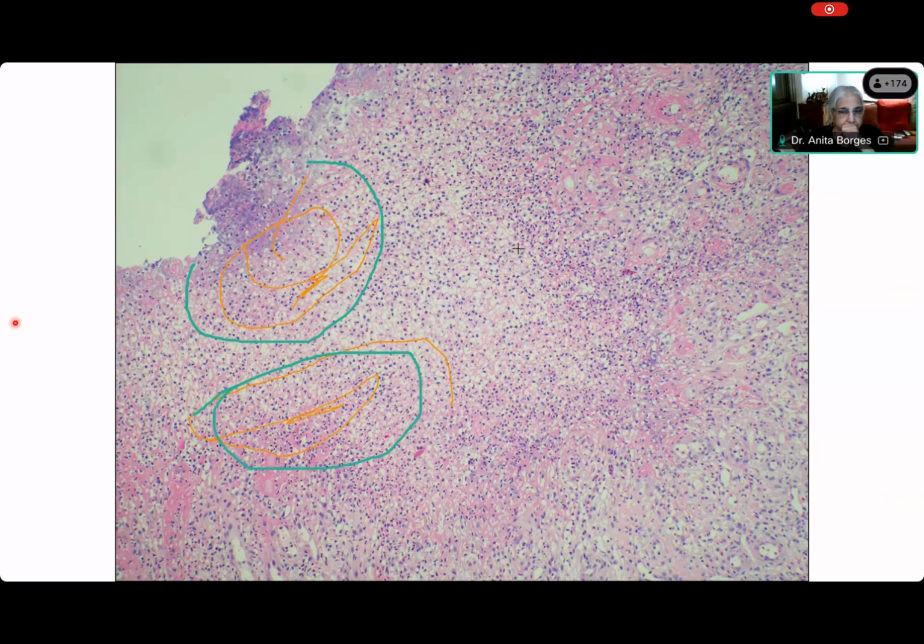Show me where is the base of the ulcer. Ma'am, should I? Where is the base of the ulcer? Ma'am, this is the base of ulcer. Where? Sorry, where is it? What color are you using? Red. So this is the base of the ulcer. Let me so everybody can see. This, according to Elsa, is the base of the ulcer.